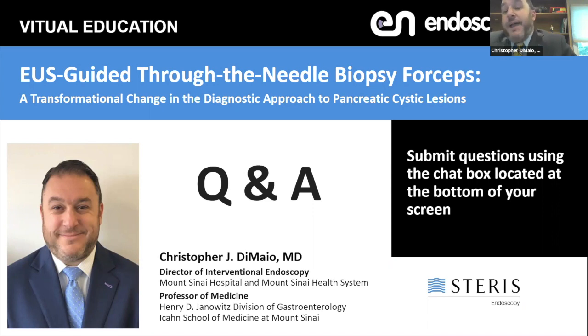At this point in my practice, if I'm going to subject a patient like that to the risk of a needle biopsy, I will most likely incorporate either the biopsy forceps, the confocal, or both. Our study showed that using both confocal and the microforceps doesn't add anything extra. The yield with using them individually or in combination is not statistically different. Then it just becomes what you're most comfortable with, what you have access to, and time limits. Currently, because we're involved in a number of studies, I am using both of them in various ways, and occasionally I'm still using them both in the same patient.